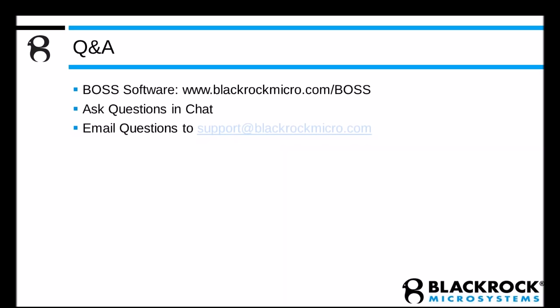So with that, let's take some time to answer some of the more popular questions that have popped up. There were a couple of questions that everyone is probably interested in. One was where to get data if you don't have any. When you go to blackrockmicro.com/boss, you'll be able to download the Windows and Mac versions of the software, and also the manual, along with both NS5 continuous data and an NEV file. You can load both of them into the program. When you load a continuous file, of course, you first have to set the threshold and extract the spikes. When you load an NEV file, that step is skipped because you already have spikes.